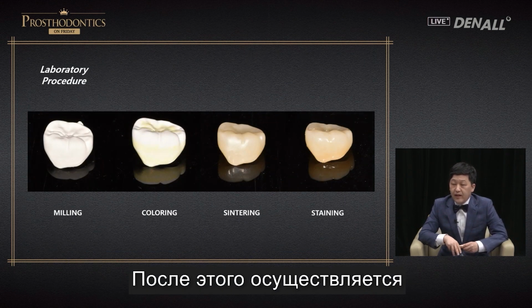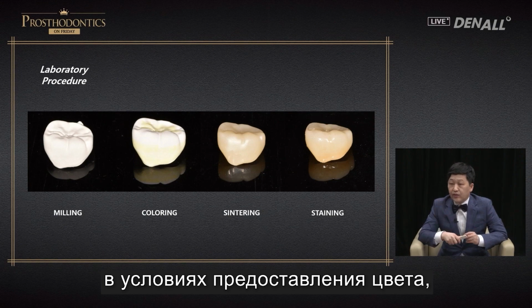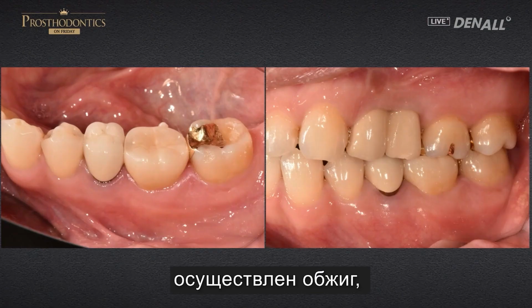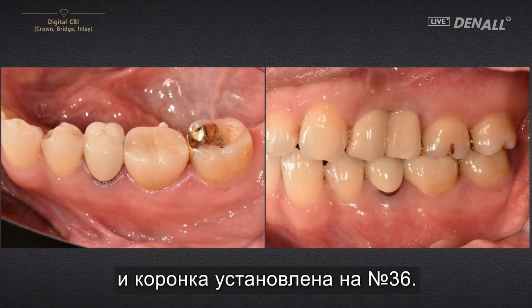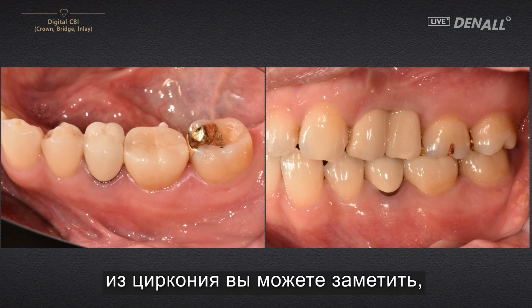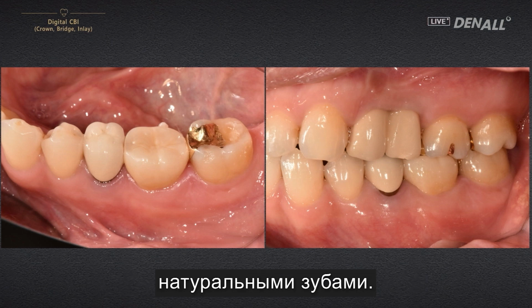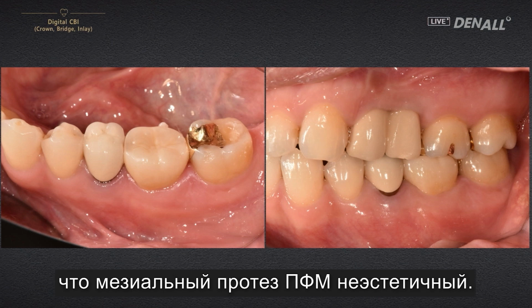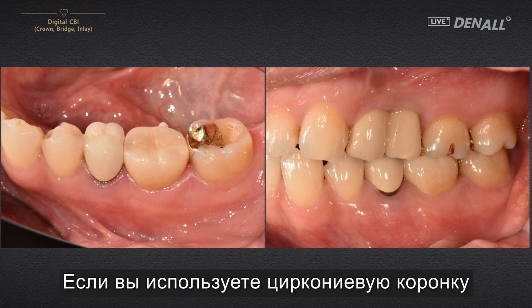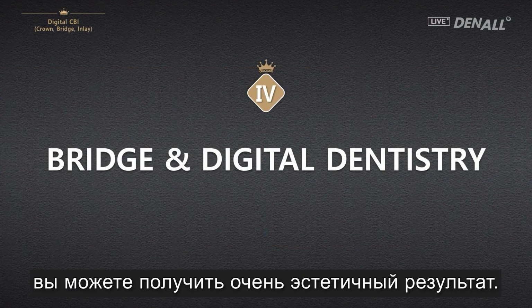After that, milling and sintering is done. Because there's a little bit of limitation with just the sintering in terms of providing color, staining is done, and the crown is done in number 36. Unlike the conventional zirconia crown, you can see that this is very aesthetic and it has balance with adjacent natural tooth. We can see that the mesial PFM prosthesis is quite unaesthetic. If you use zirconia crown as well as digital technology, you can get very aesthetic results.